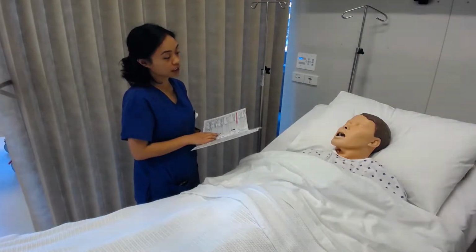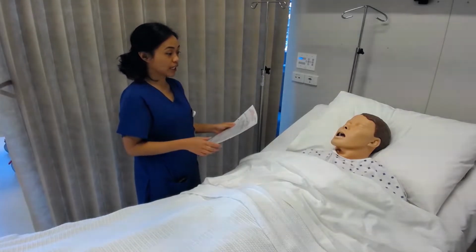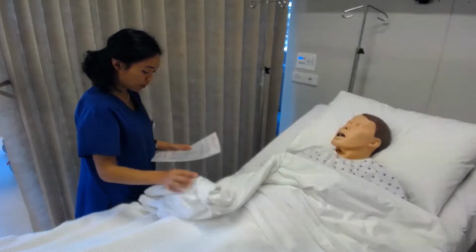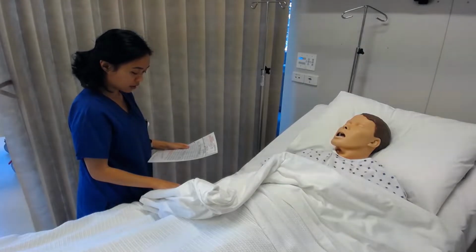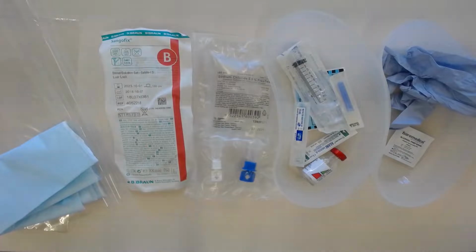When confirming patient identity, ask the patient to state their full name, date of birth, and confirm this with the medication chart and the patient's identification band. Check the patient's MRN, or medical record number. After leaving the patient bed space, check the medication prescription for legality.